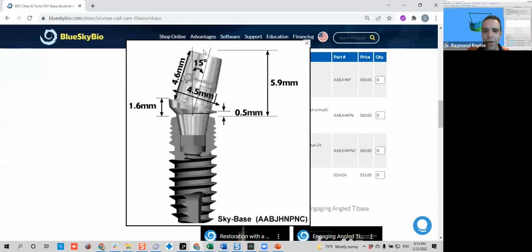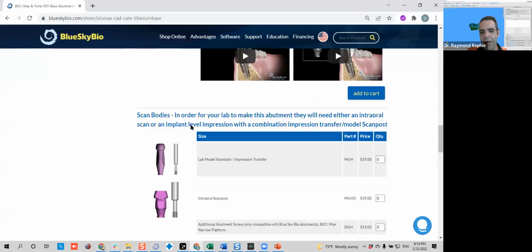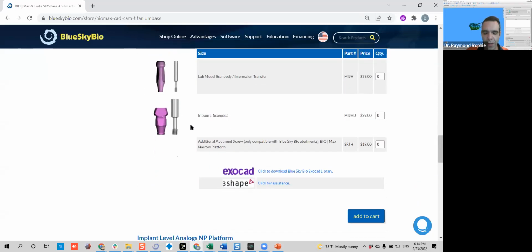Because of the diameter of the abutment, if you use the angled screw channel, you will be able to correct only 10 more. However, if you need to correct even more, you can always create a slot on the titanium base. You can perforate it so you can access with your angled screwdriver, and you can now torque your abutment from that insertion direction.